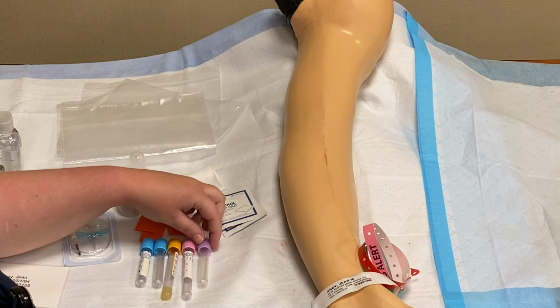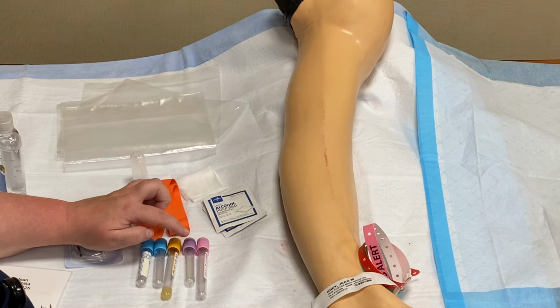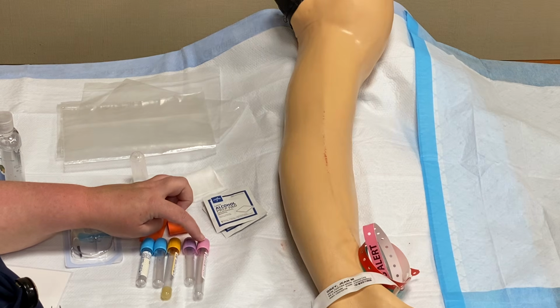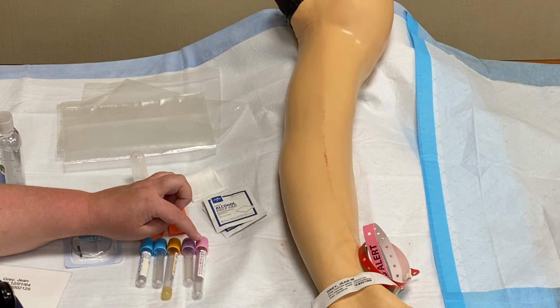We're also going to be drawing a lavender tube, which is our CBC, a complete blood count, so it tells us about your different types of blood cells. We're also drawing a type and screen, which is to check your blood type. If she tells me she knows her blood type, I'll let her know for her safety. We want to have it on record at our hospital, so that's why we're going to check it anyway.